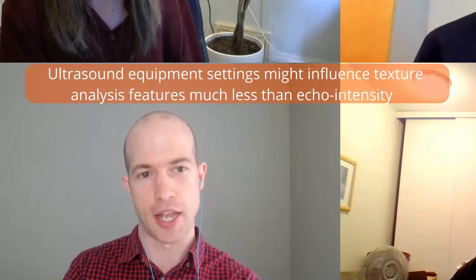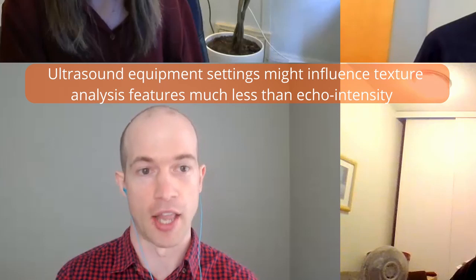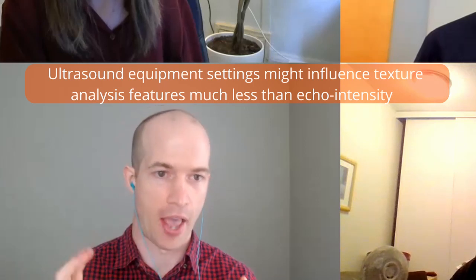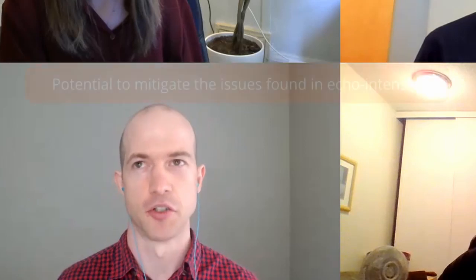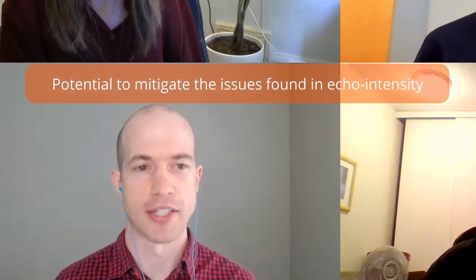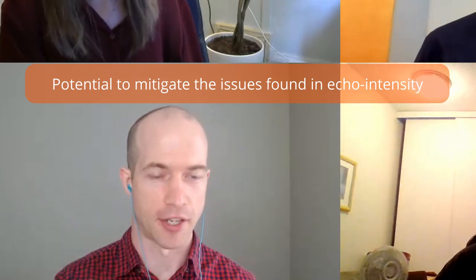And so the ultrasound equipment settings might influence these features a lot less than these echo intensity type features. So it has the potential to mitigate some of those issues, but at the same time, no one's really examined how these texture features compare to these physiological measures.